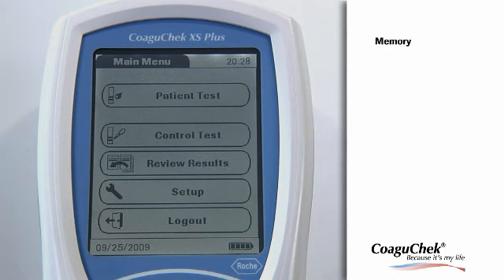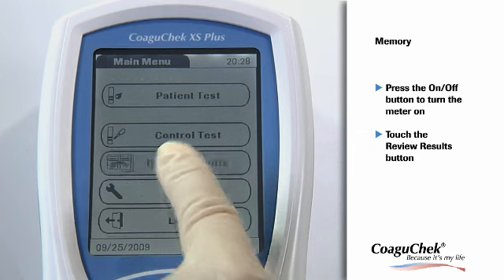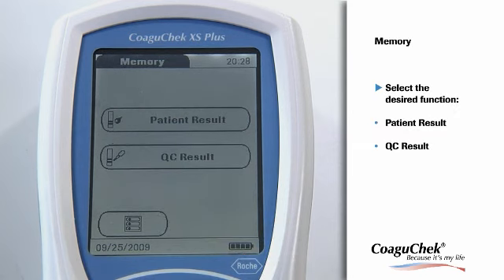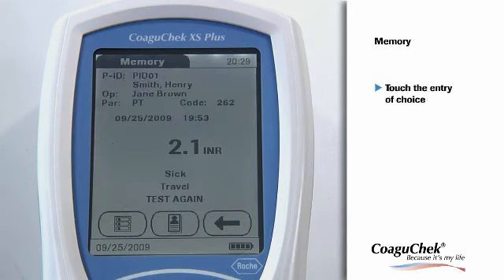The Coagichek XS Plus meter can store up to 1,000 INR results plus 500 quality control results with time and date. First, press the On-Off button to turn the meter on. If you want to view the INR or quality control results, please touch the Review Results button. To view the memory area for INR results, please touch the Patient Result button. Here you can find all test results for your patients. Touch the entry you want to open. Together with the result, the patient ID and name, operator ID, parameter tested, code number of the strip, time, date, as well as up to three comments are displayed.